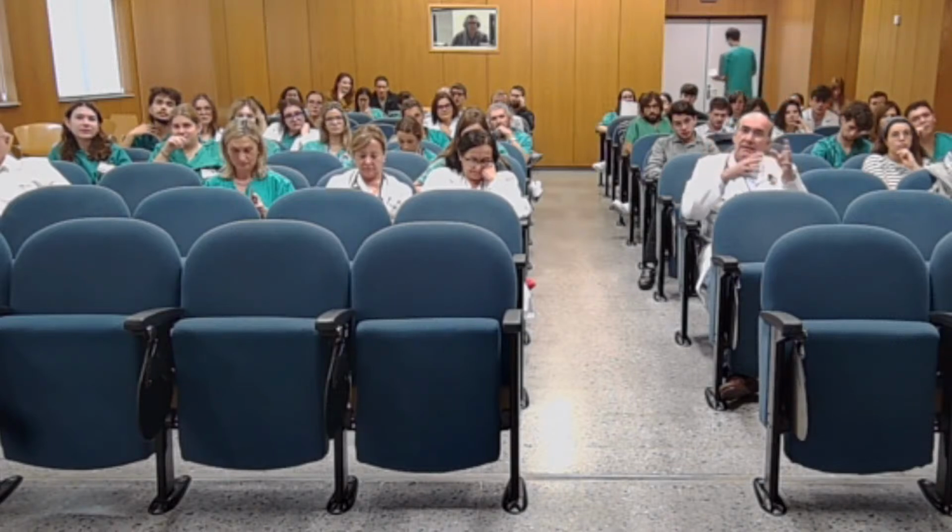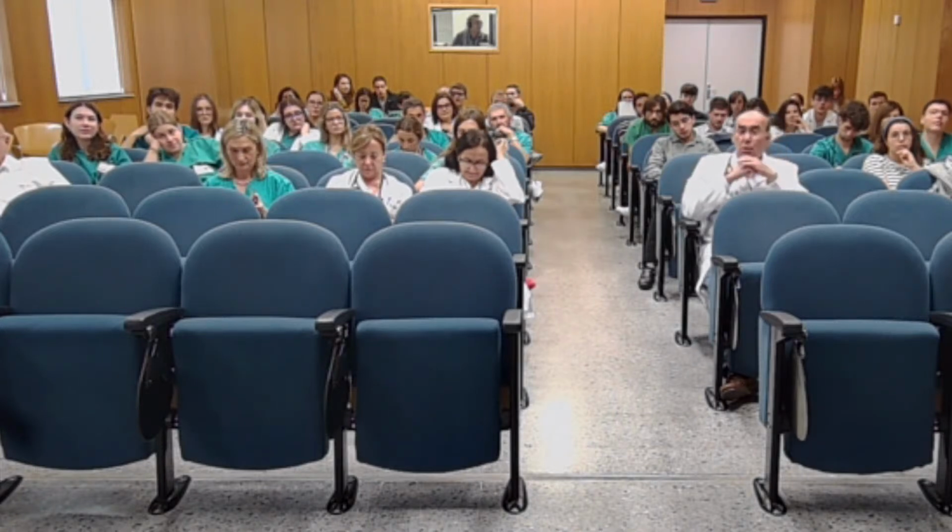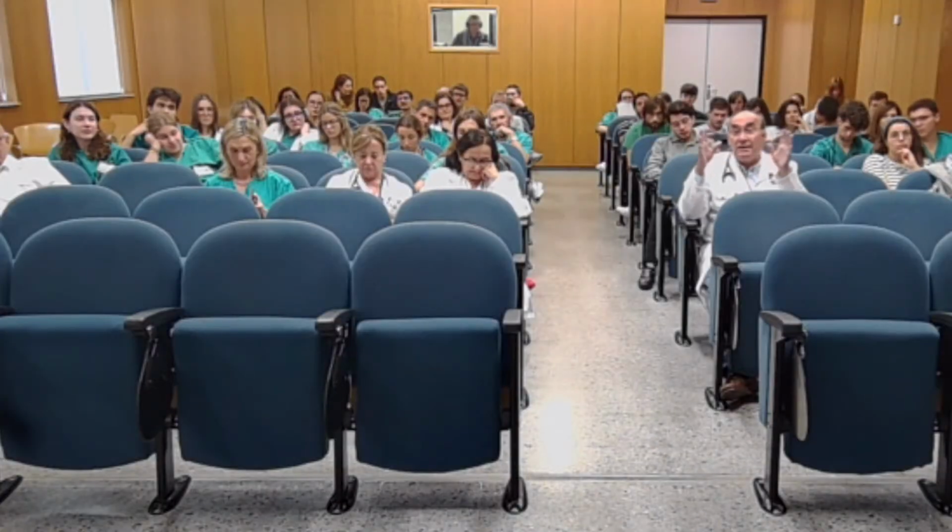¿Crees que alguna técnica de imagen nos va a poder ayudar, sobre todo en esa capacidad de predecir la respuesta al tratamiento? Al inicio no. Cuando empezamos el tratamiento, no hay ninguna posibilidad de predecir la respuesta. Pero durante el tratamiento, la resonancia permite ver que si el extracellular volume no ha mejorado en los primeros tiempos del tratamiento, es una señal de que probablemente el paciente no va a mejorar.